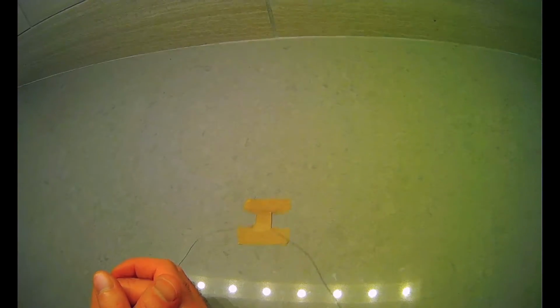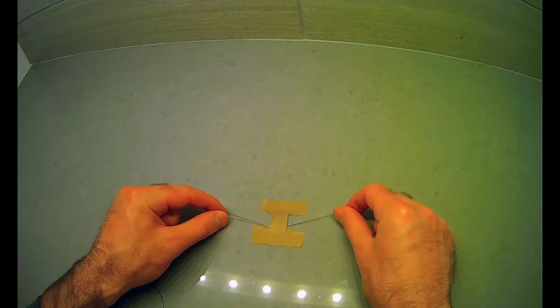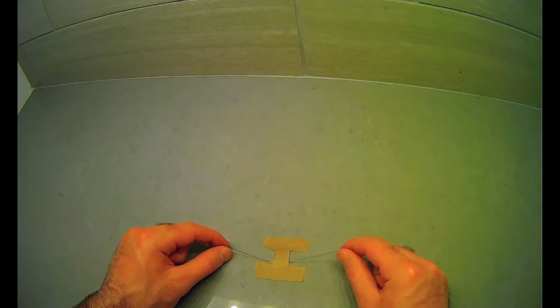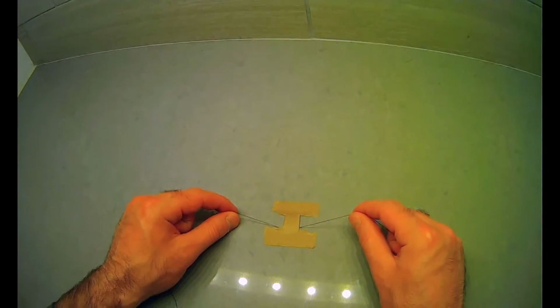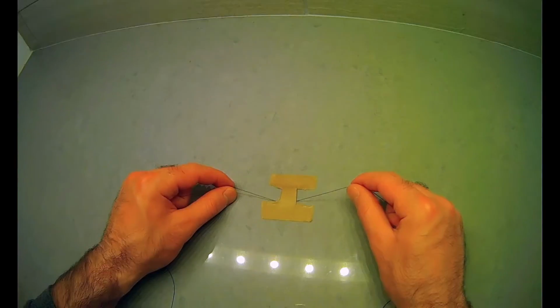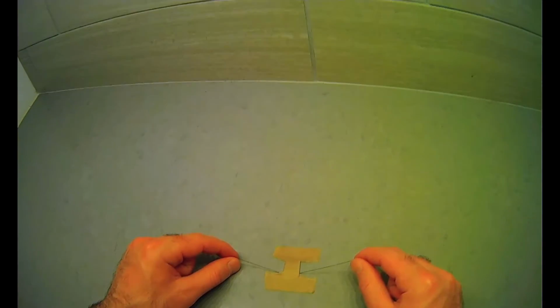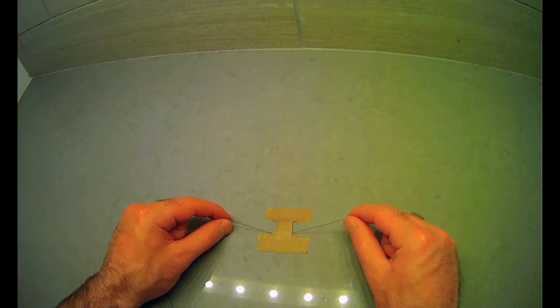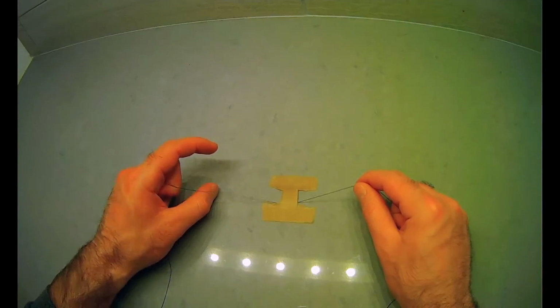So to start, for a two-handed suturing knot, what I want you to keep in mind is that this may seem to get a little complicated, but all you have to do is remember that you're literally just tying a knot, and you're tying it around your finger. So we're going to go through the steps and make sure that it's very, very obvious, so if you ever forget something, you can kind of reason your way through it. For the two-handed knot, you can use either hand. Arguably, you should get good at doing it both ways. I like to use my offhand, and again, orientation is very, very important. What you do is, now you're using your thumb. So for this first knot, we're going to be basically tying the knot around our thumb.